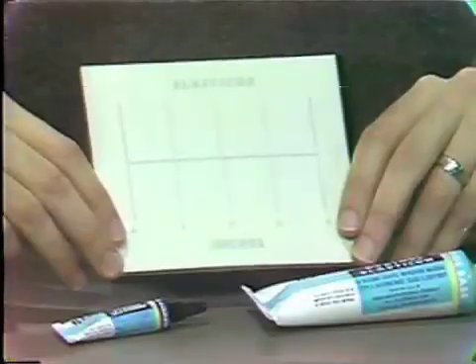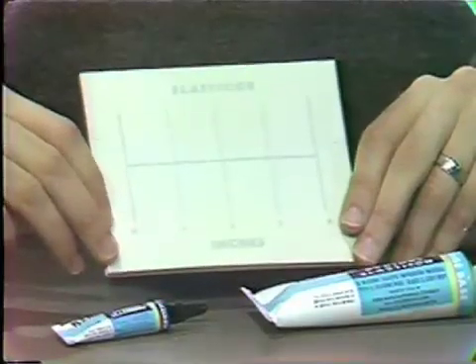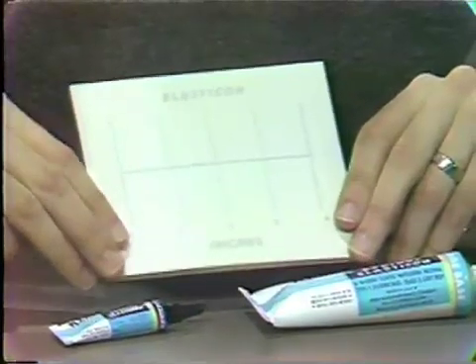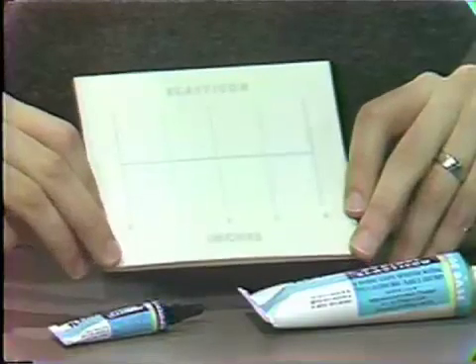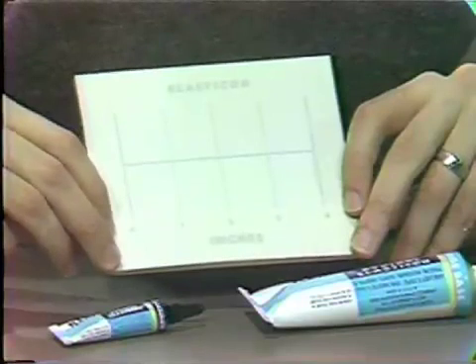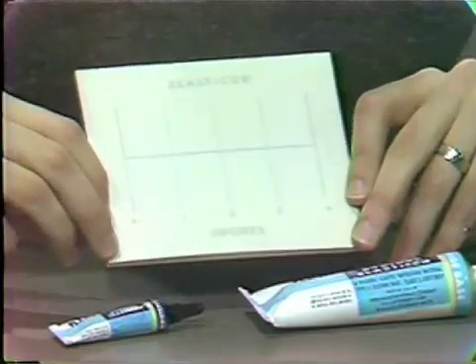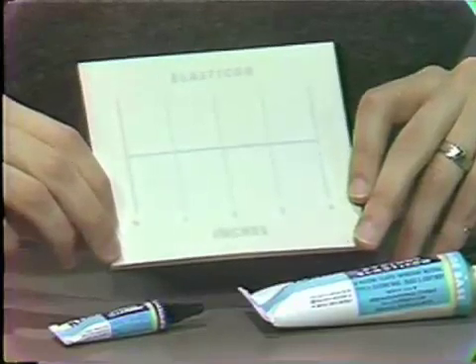A mixing pad is also provided with the Kerr system, which is calibrated in inches so that for a given situation, one inch, two inches, or three inches of base may be necessary. One drop of liquid accelerator is added for each inch of base material.